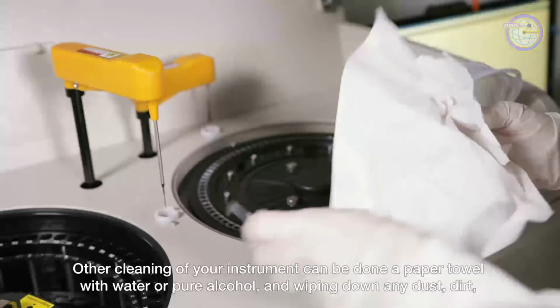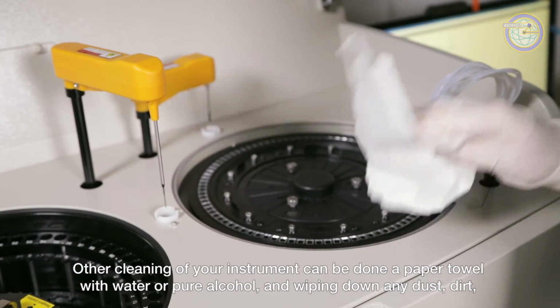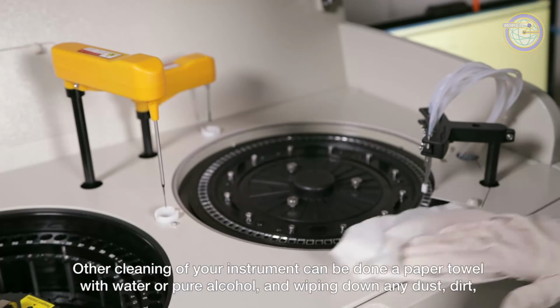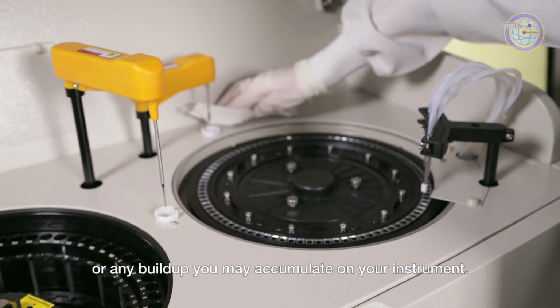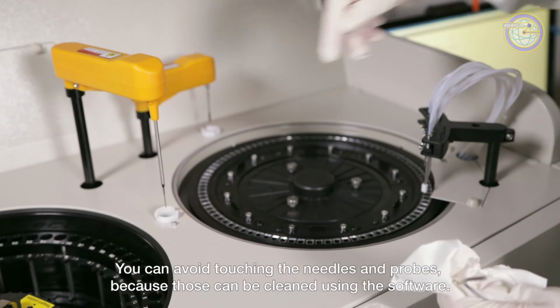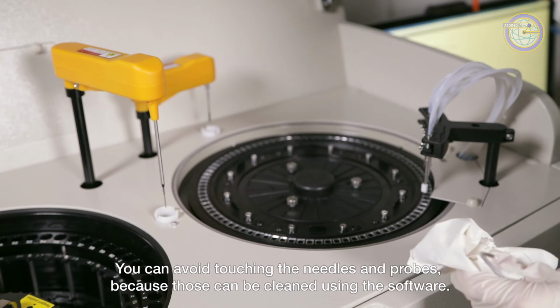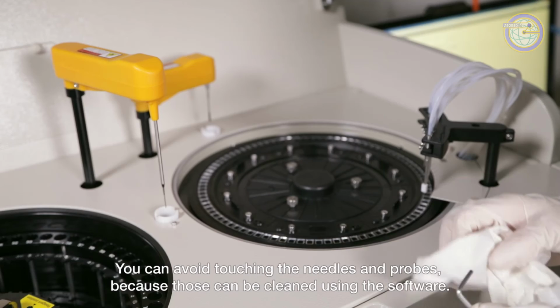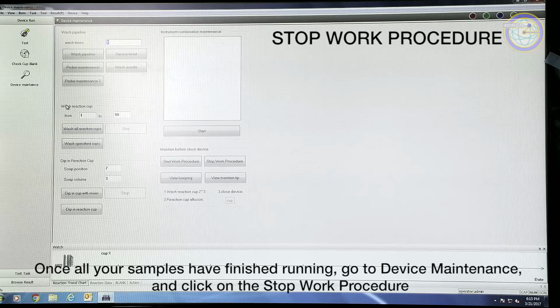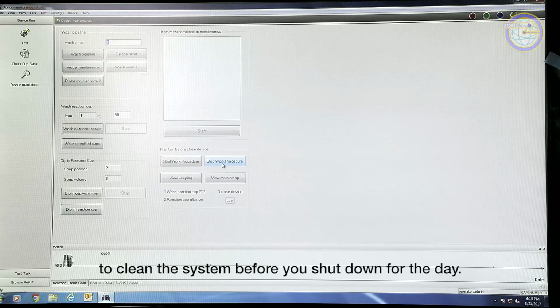Other cleaning of your instrument can be done using a paper towel with water or pure alcohol and wiping down dust, dirt, and any buildup you may accumulate on your instrument. You can avoid touching the needles and probes because those will be cleaned using the software system. Once all your samples are finished running, go to Device Maintenance and click on the Stop Work procedure to clean the system before you shut down for the day.